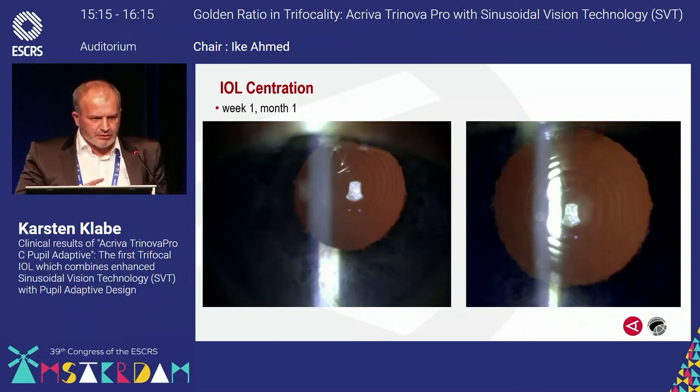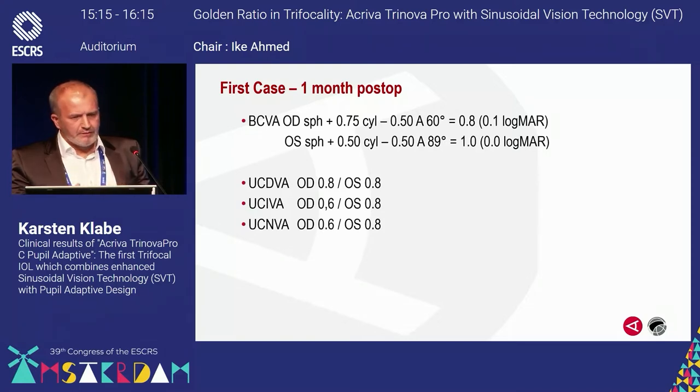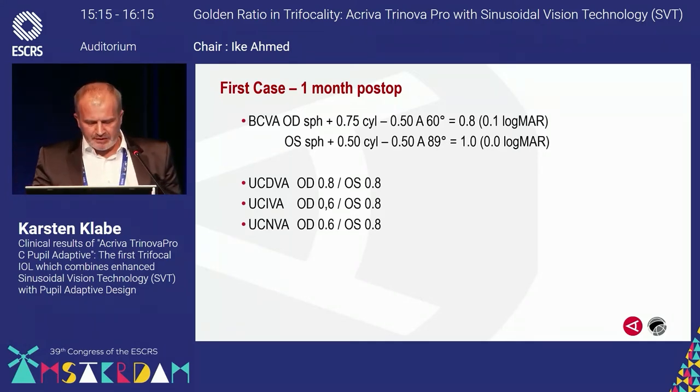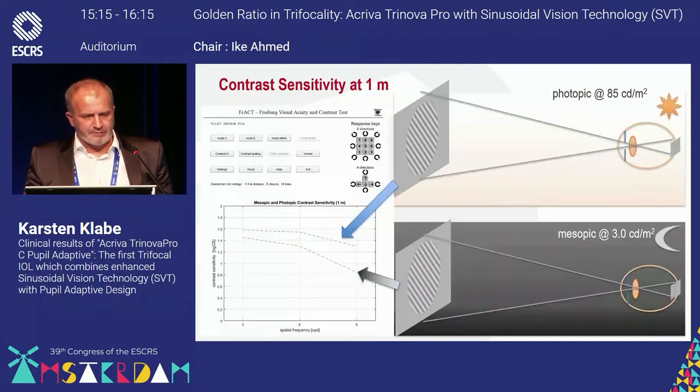Here you see two pictures of the centration of the intraocular lens, week one and month one after surgery. Perfect centration, really surprised about this. And that is the visual acuity, 0.8 or logMAR 0.1, and 0 logMAR at 1 month post-op. Ike pointed it out very well that these patients underwent more or less refractive surgery, so we are looking for the best uncorrected visual acuity achievable. And so 0.8 far view on both eyes and 0.6 to 0.8 in intermediate and near visual acuity. So I think a really satisfying result in our first patient.